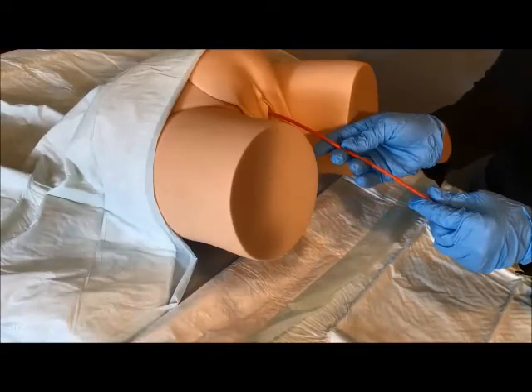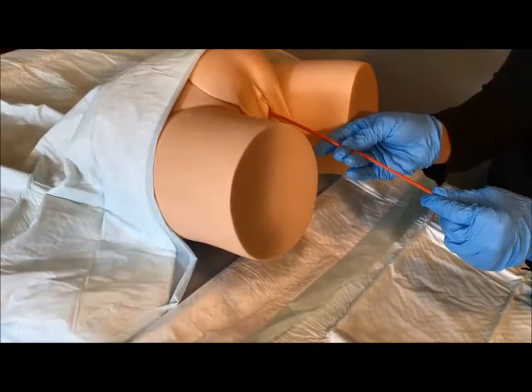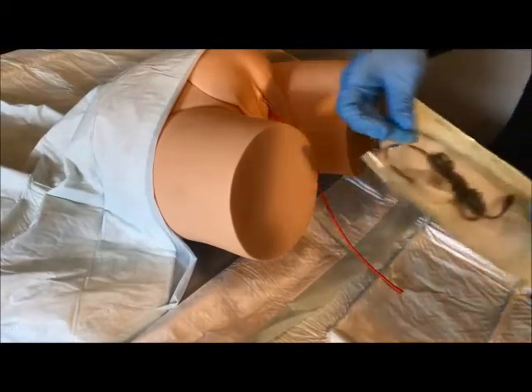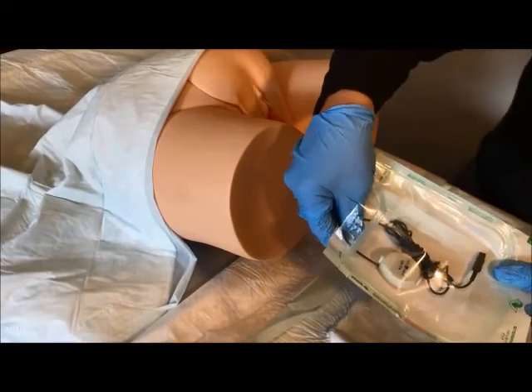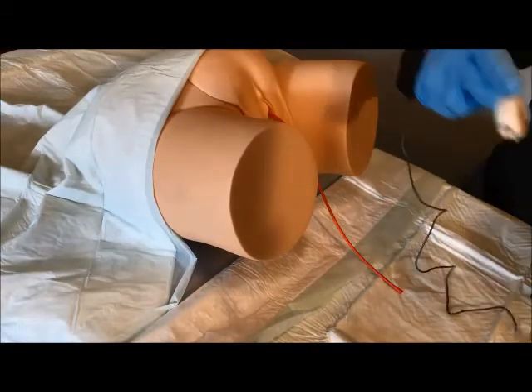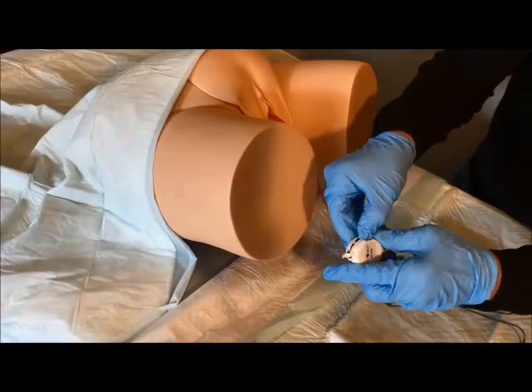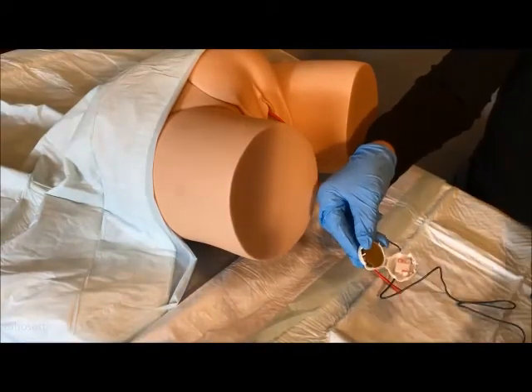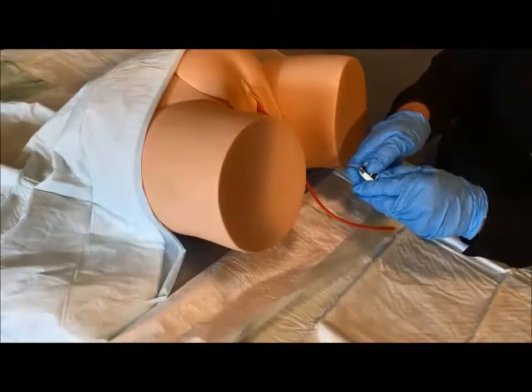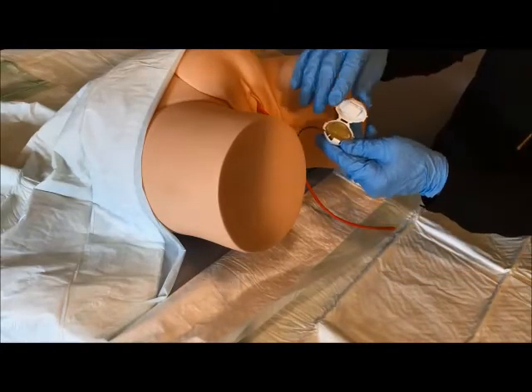With the urinary catheter inserted and in place, we can start the product application. First, gently pull on the catheter until you feel slight resistance. Then remove the actuator from the package and untangle the wire. Then peel off the protective covers — remove the first tape, then remove the second tape.